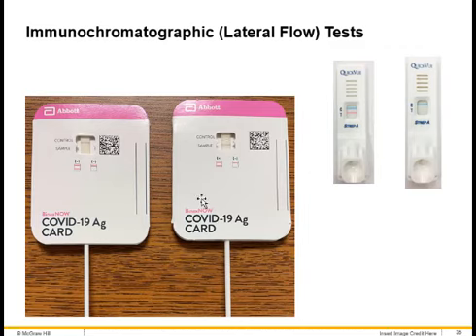So this is the Binax test for the COVID antigen, and it's something that they have at home. I wish these were more like $1 a kit rather than like $10 a kit or whatever they are. But we're just not quite there yet. But I think that in the future, this will get to be a lot cheaper. So if you're concerned, you'll be able to just do a test and say, okay, well, if I am sick or if I have the antigen, I'm not antigenic enough to create a positive line on this test, which means that it's okay for me to go and do what I need to do.